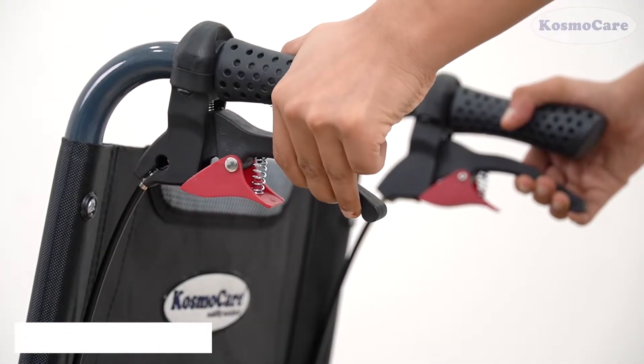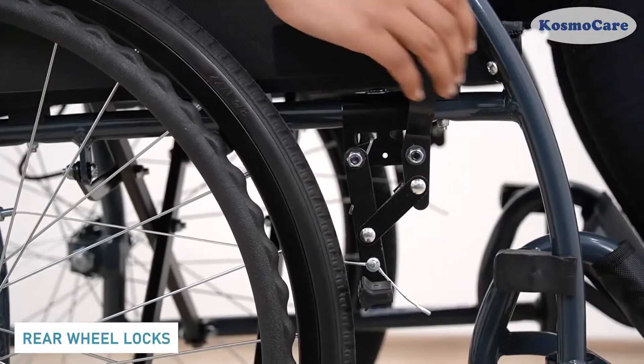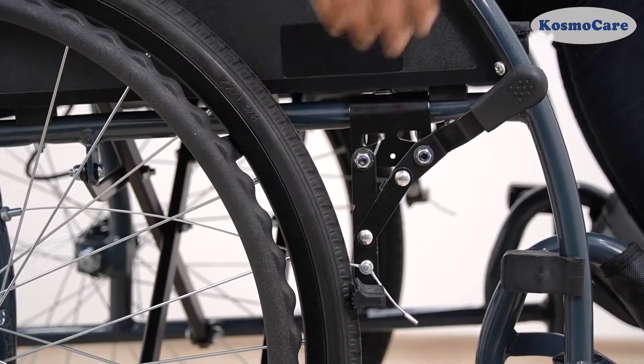The wheelchair is equipped with easy-to-apply brake levers for the caregiver. And when at rest, this accessible wheel lock lever securely locks the wheels.